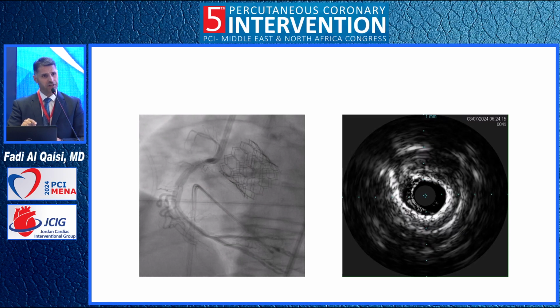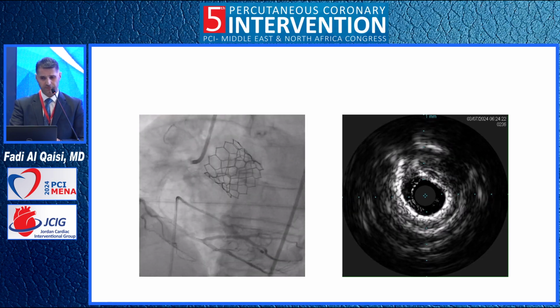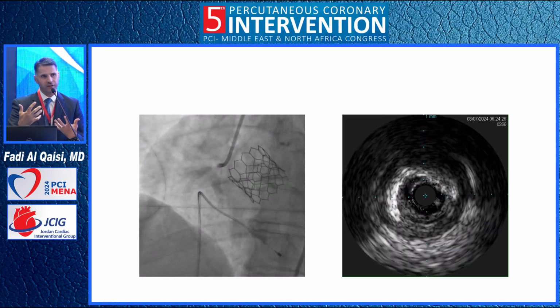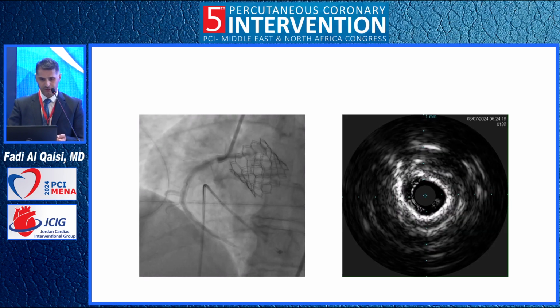This is our patient earlier with the calcifications of the artery, for whom, by the way, I did TAVI at the same time. And this is his IVUS. You can see the heavy calcium. I told the patient, I cannot do this with the regular balloons. I must do rotational atherectomy for you.